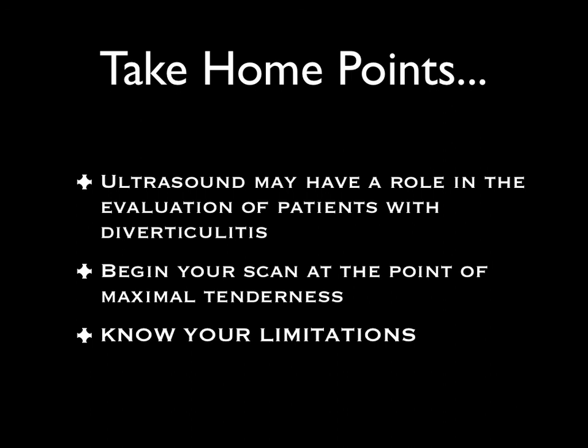Remember to begin your scan at the point of maximal tenderness and know your limitations. Obesity, bowel gas, and inability to access certain regions of the colon may make your scanning challenging.